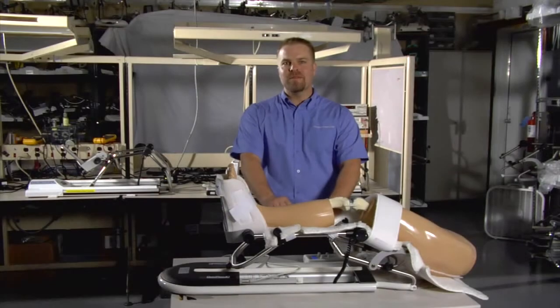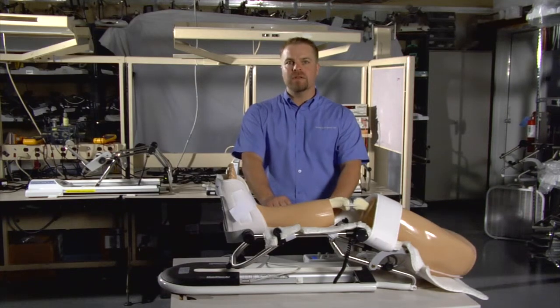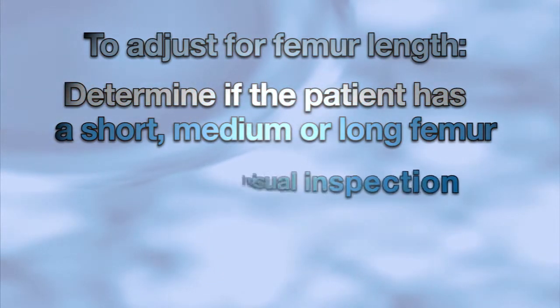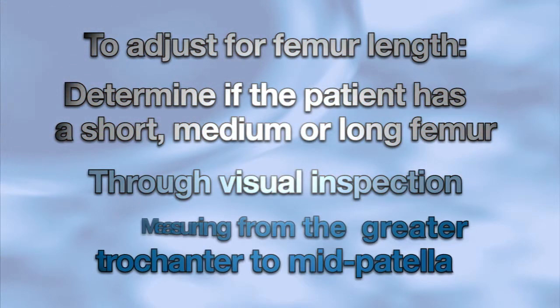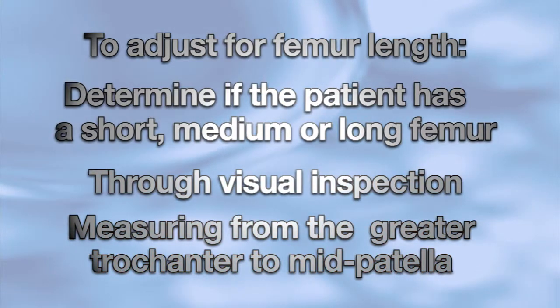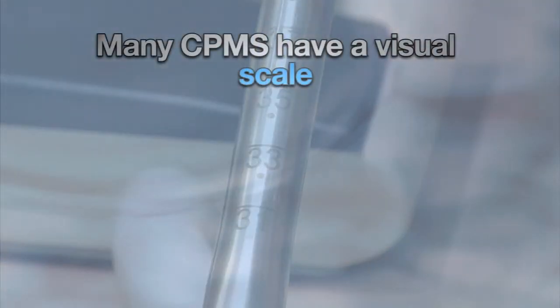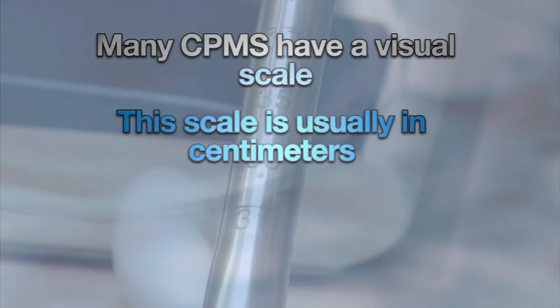Adjusting femur length may be one of the most overlooked steps in fitting the CPM machine properly to the patient. It is, however, one of the most important. To properly adjust for femur length, you must determine whether your patient has a short, medium, or long femur. This can be done by visual inspection or by measuring from the patient's greater trochanter to their mid-patella. Many CPM machines will have a visual scale on the orthosis itself. This scale is usually in centimeters.